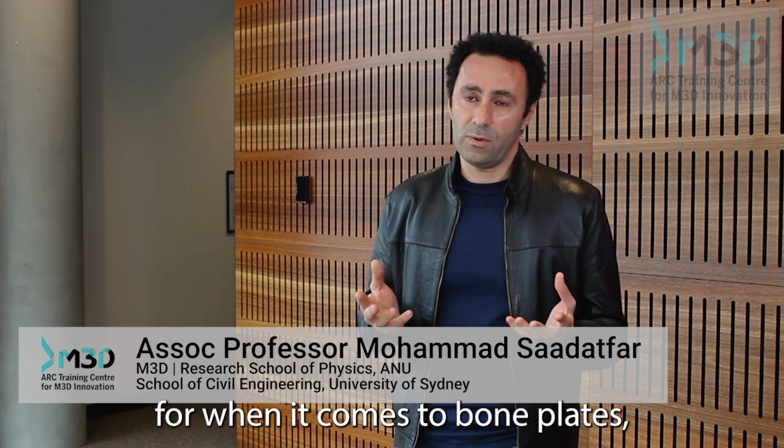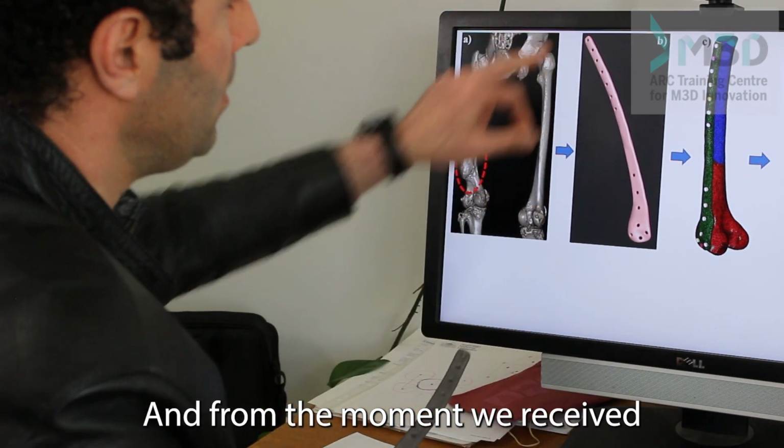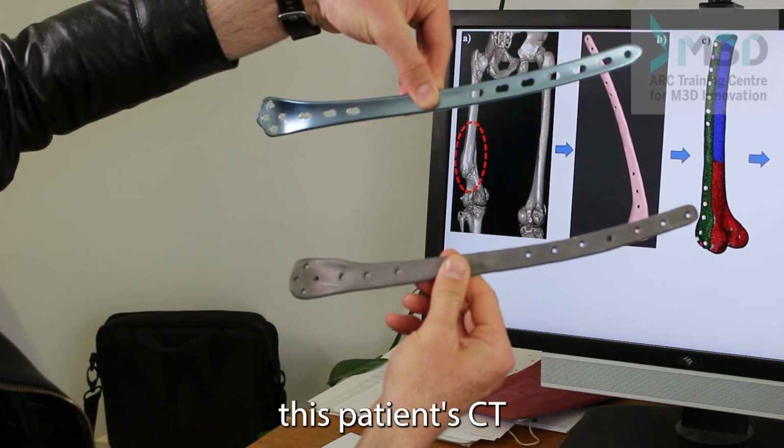Currently, there are very limited options available to patients when it comes to bone plates. It takes anything between 6 months to a year to do a plate customization for a bone injury. And it's often upwards of $50,000, right? But what we did here was fast, really cheap, and from the moment we received the patient's CT scan from the hospital to the point that we had a customized plate based on the anatomy of that specific patient, the whole process was around 10 days.